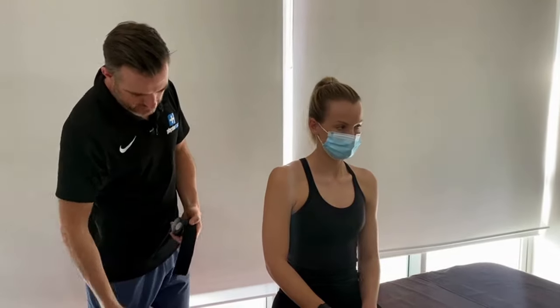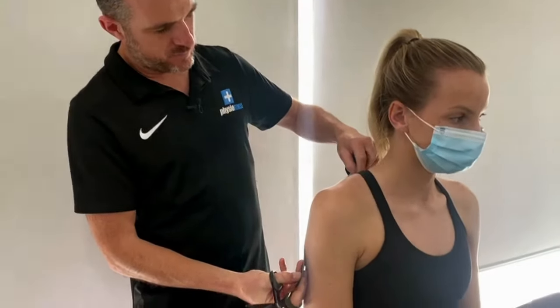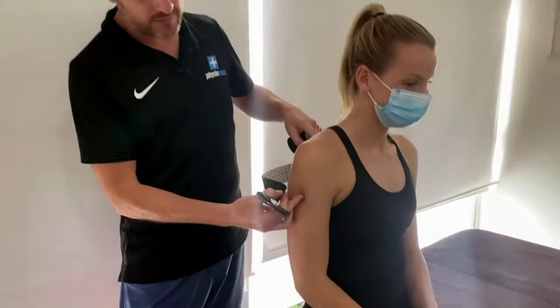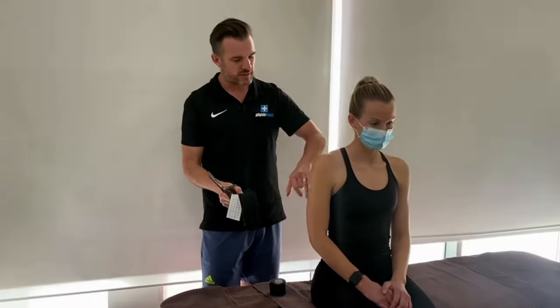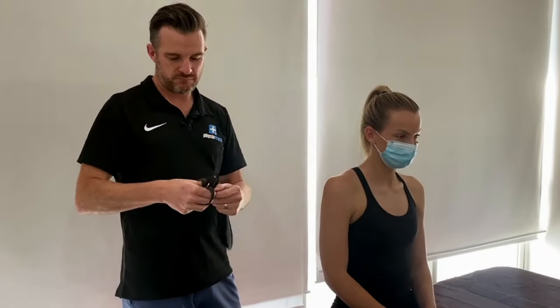I'm going to show the KT taping now. I use KT tape because I want a spring suspension — I don't want to use rigid tape as it gives me a lot more to work with. I tend to take three strips from scapula to their deltoid, so measure that out and cut three roughly the same length. You definitely want to round the edges because they're going to be wearing close-fitting tops and you don't want the tape coming off, so round off the edges to reduce the likelihood of things catching and ripping the tape off.